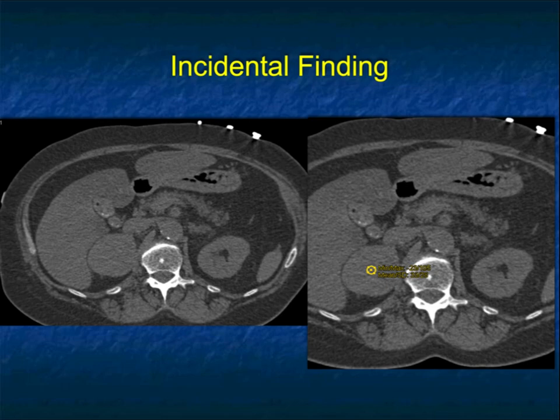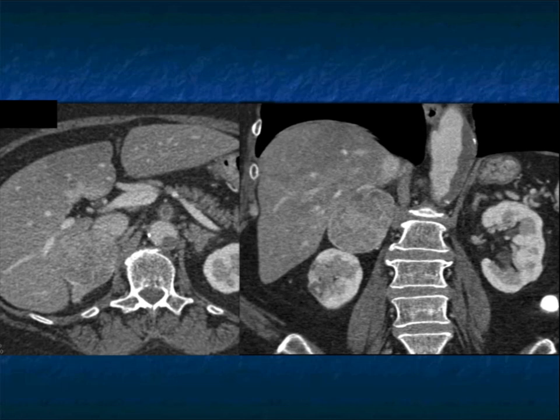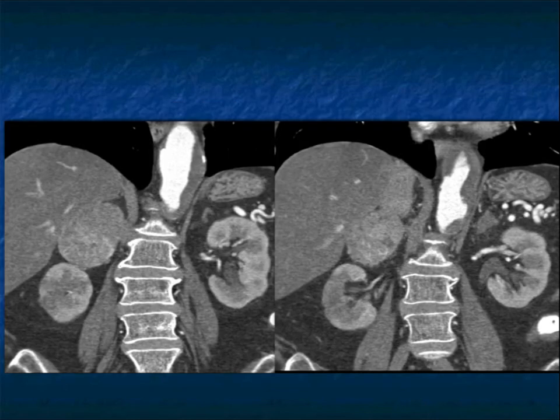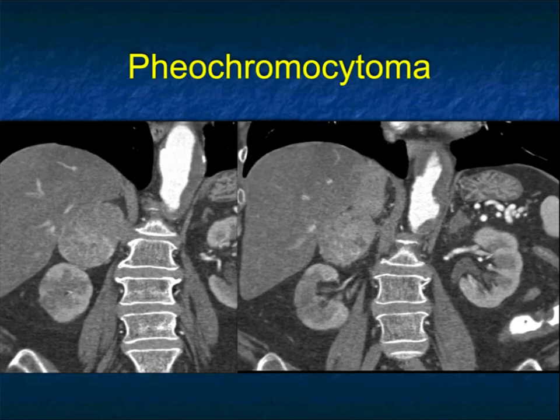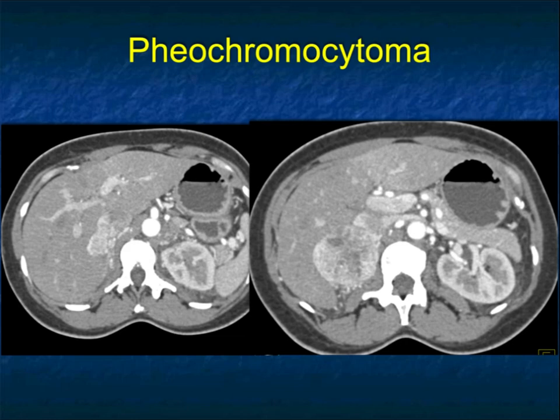Another incidental finding — a right adrenal solid, smooth mass. It enhances on arterial and venous phase imaging, but not all that much. It's not as vascular as some of the lesions shown, but it is somewhat vascular. Lab values are important to get. This was also a pheochromocytoma. So I've now shown you very vascular lesions, lesions that are somewhat cystic, and lesions that are not very vascular — there's really a range.